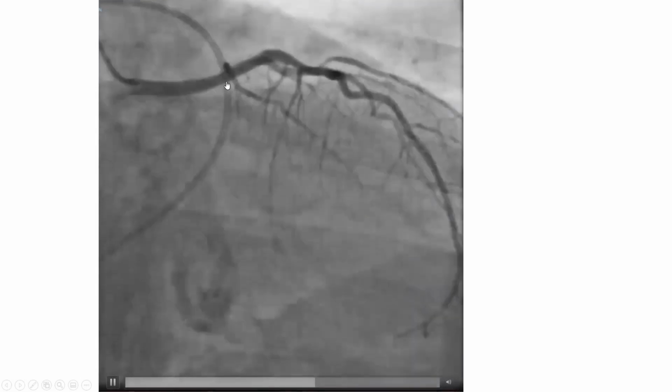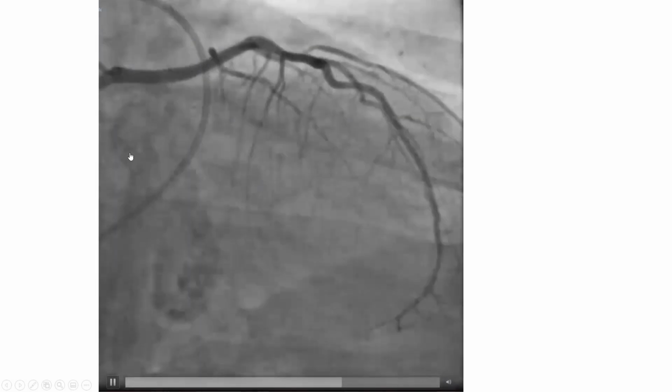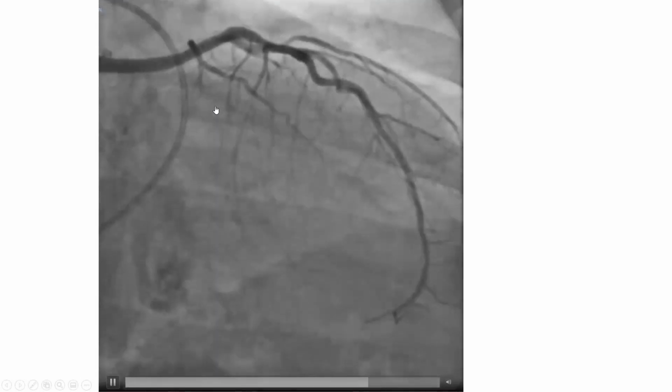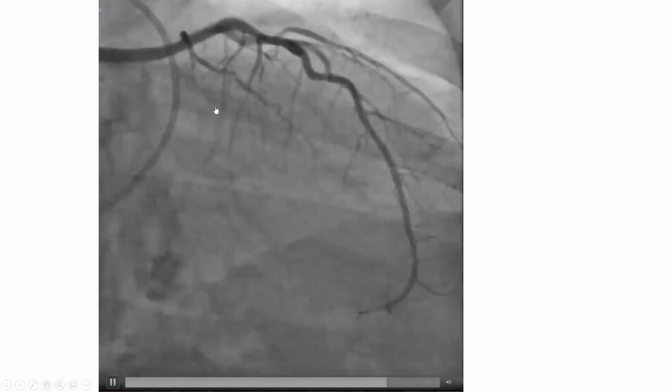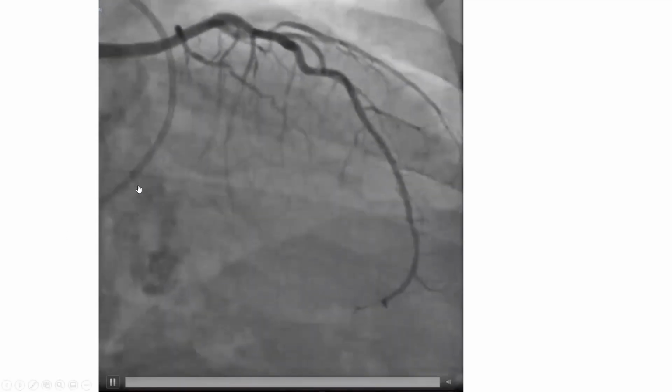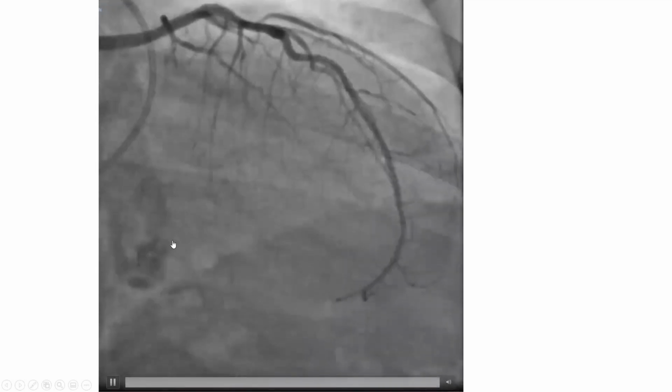And actually what I'm seeing here is not a left main. This is actually an LAD, and the left circumflex is coming from somewhere else. So again, reflex: you see a long left main, think anomalous left circumflex, and what I'm seeing here is the LAD, left circumflex is somewhere else. And again, like I explained earlier, the coronary sinus will help you. In those cases, wait late on your cine and wait to see that venous phase and the coronary sinus filling, which will tell you, okay, the coronary sinus is here, the AV groove is here, but I do not see a circumflex, okay?